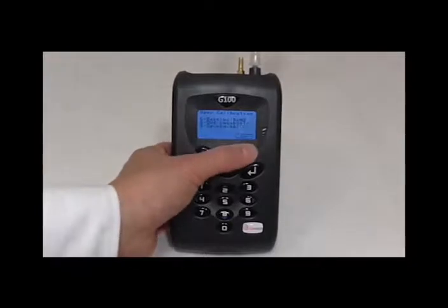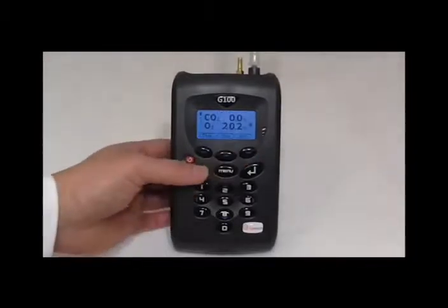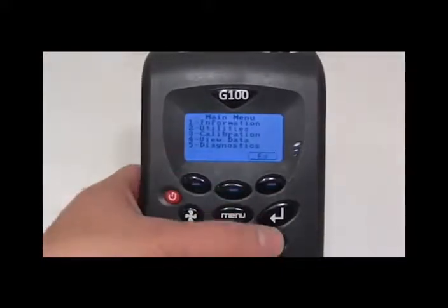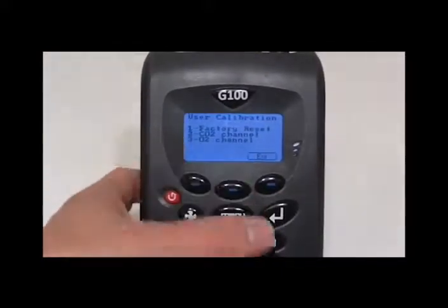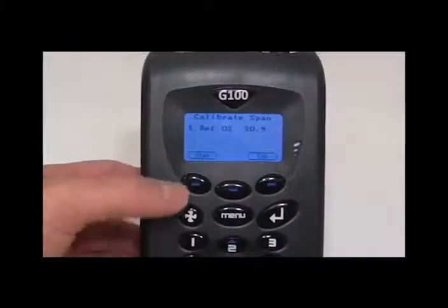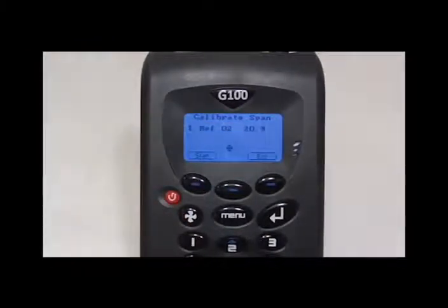Once the carbon dioxide channel has been calibrated, we move on to the oxygen channel. We generally recommend to span calibrate the instrument around the expected measuring levels. So if you have access to calibration gas, please use this as the reference. If calibration gas is not available, calibrating it in air would also suffice, but please bear in mind to carry it outside or in a well-ventilated area, i.e. not in the office.